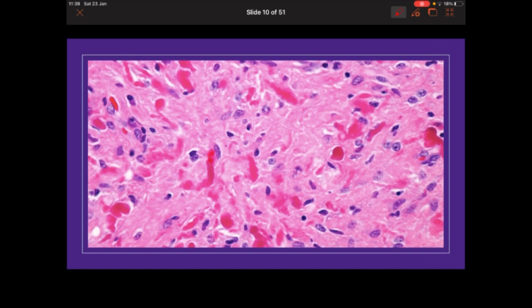There are so many Rosenthal fibers. These are brightly eosinophilic Rosenthal fibers. They can be tapered, corkscrew shaped, brightly eosinophilic hyaline masses. They are all intracytoplasmic. And in this slide, we can also appreciate the presence of these hyaline globules. These are also brightly eosinophilic materials, intracytoplasmic eosinophilic materials.